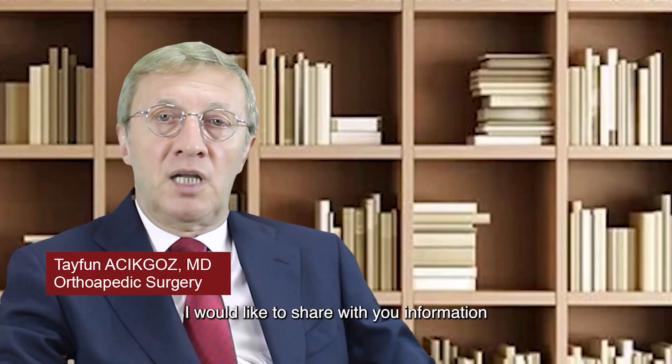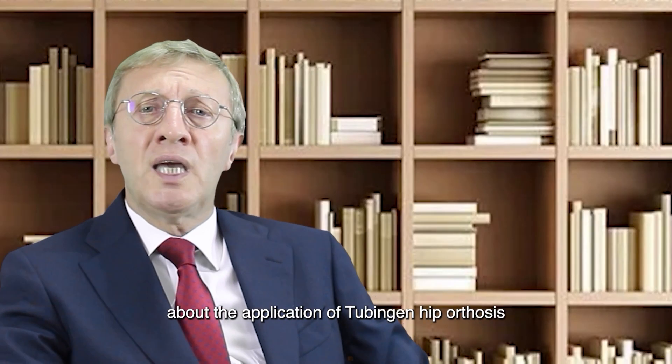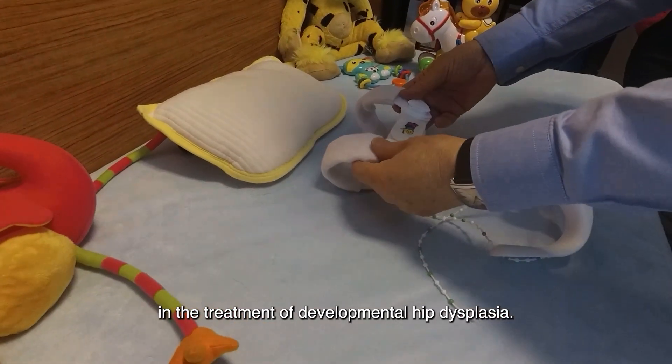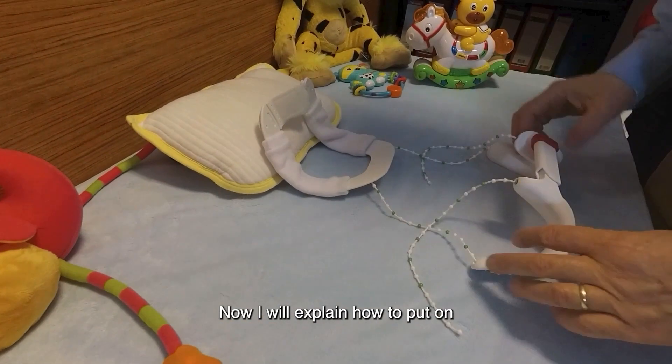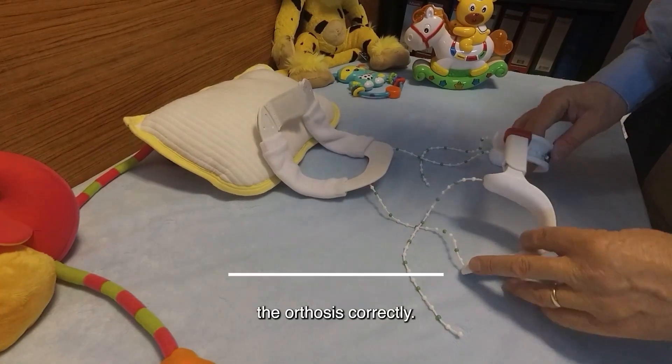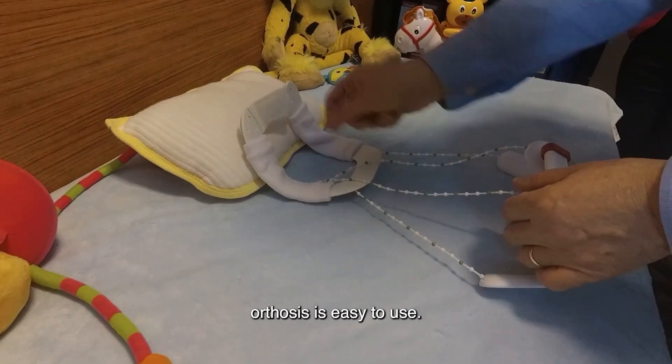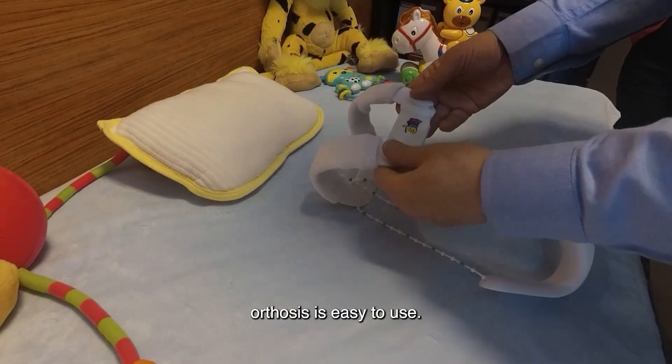I would like to share with you information about the application of the tubing and hip orthosis in the treatment of developmental hip dysplasia. Now I will explain how to put on the orthosis correctly. I would like to point out that the orthosis is easy to use.